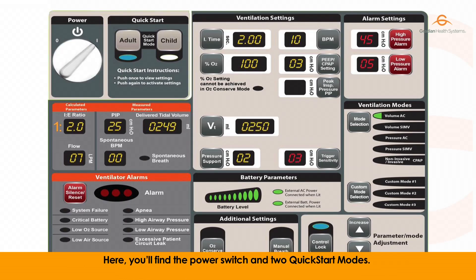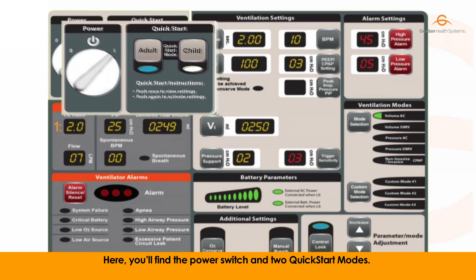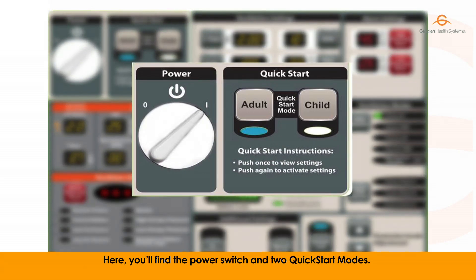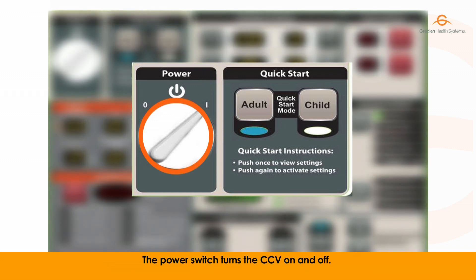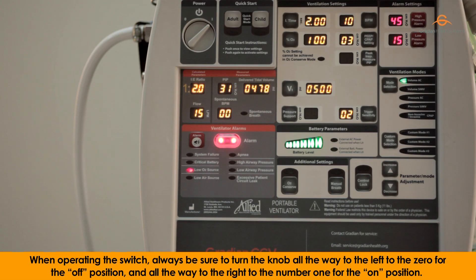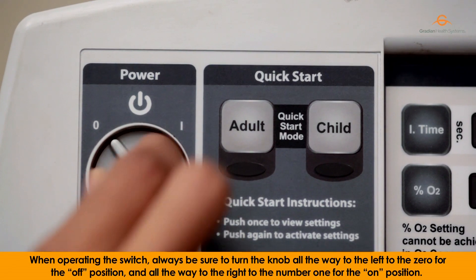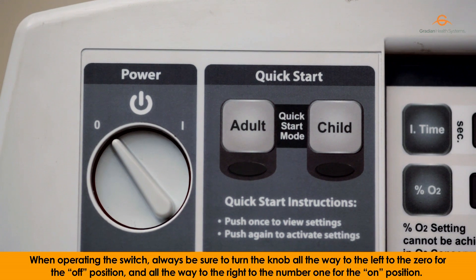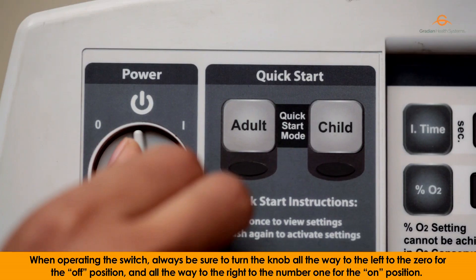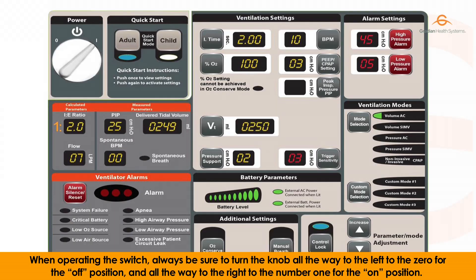Here you'll find the power switch and two quick start modes. The power switch turns the CCV on and off. When operating the switch, always be sure to turn the knob all the way to the left to zero for the off position and all the way to the right to the number one for the on position.